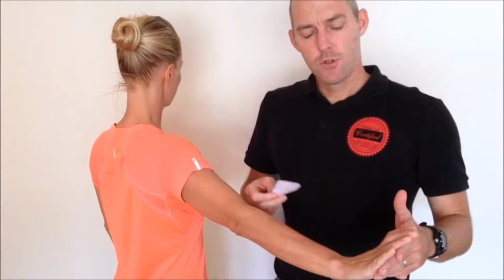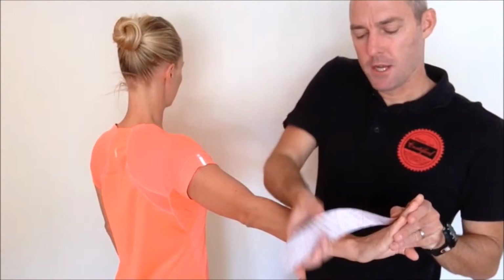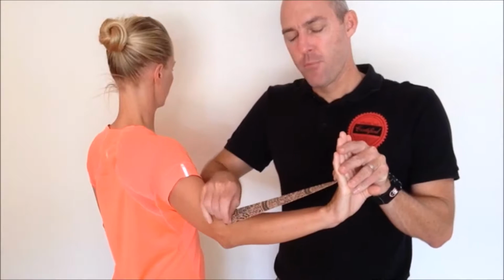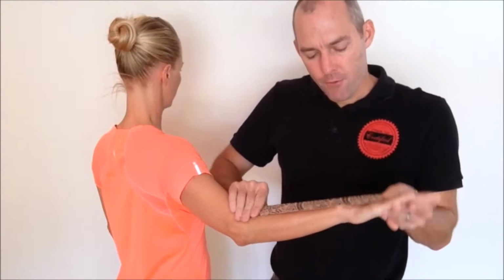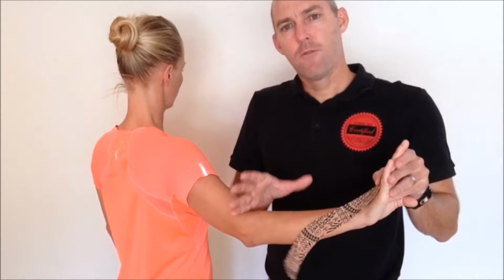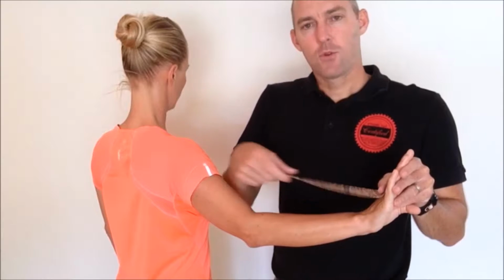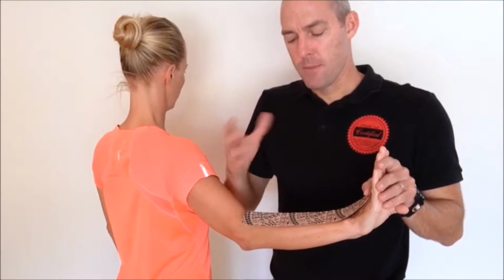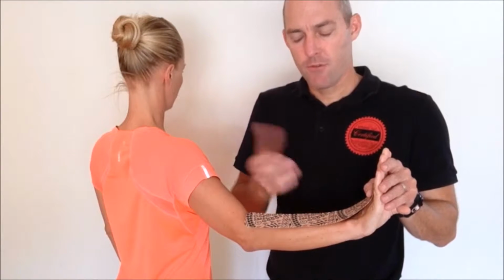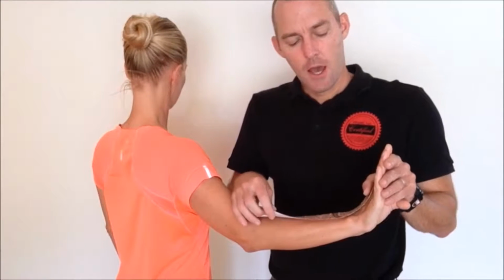Again, those of you who are used to using kinesiology tapes might be used to doing what we call a bridging type technique, where you would put one end on and then put your other end on and then bring the wrist down to bring the tape in contact with the skin. Now again, we want to avoid those sorts of applications with our dynamic tape. Again, we're talking about much higher forces here, many kilograms compared to grams. We're going on in that really short position to really pull on things.